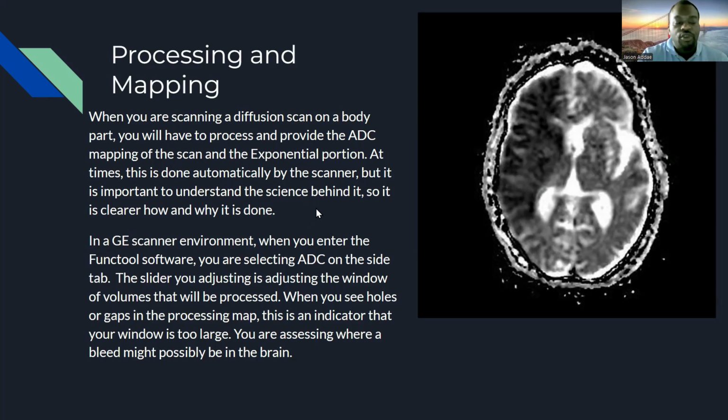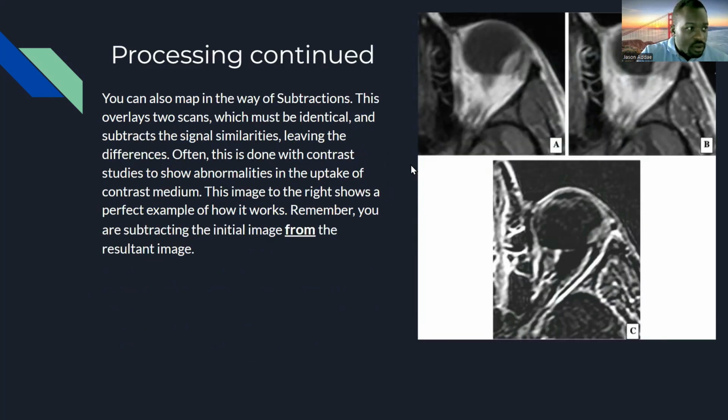The principle is just that you're separating and contrasting portions of an image in order to extrapolate a certain material, matter, or pathology. And it's just using the software to do that. So this is what gets into more of that here, subtractions. When you take two images, you remove the anatomy to show only pathology by overlaying the images.